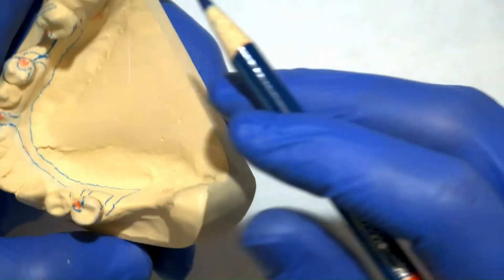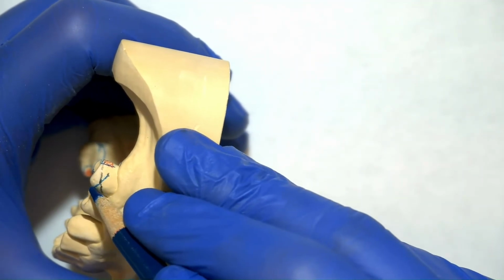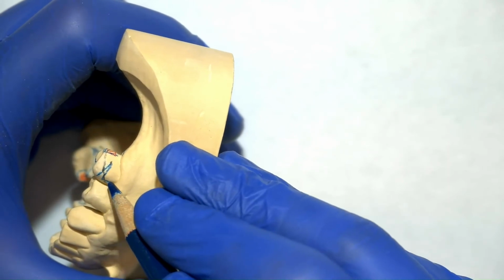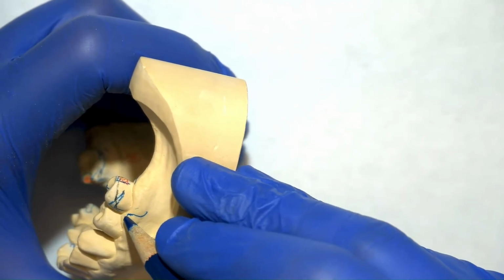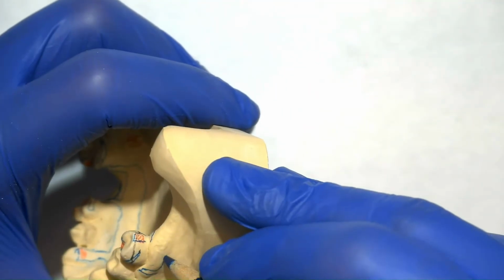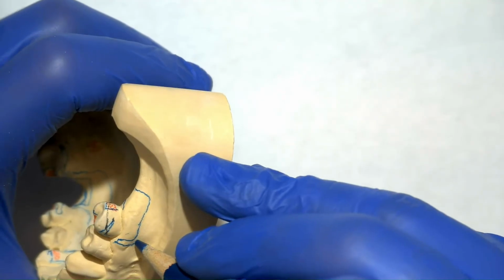Now, once that's done, we're going to go ahead and transition into the modified T. The modified T starts at the undercut, goes up over the height of contour, and then transitions into more or less kind of like an I-bar clasp, which is going down like that, straight across the free gingival margin, and then back around, skipping one tooth, and then you have the origin right here.